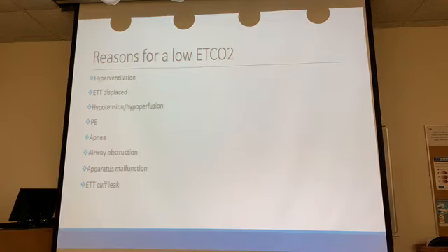Apnea, patient's not breathing, you're not gonna have carbon dioxide coming out. If there's a total airway obstruction, you got a big mucus plug stuck in that endotracheal tube or even in their trachea, they're not gonna be able to exhale CO2. They may not have a CO2 reading. Obviously, if your apparatus is malfunctioning, that's another reason. Or if you have an endotracheal tube cuff leak, your cuff is popped or there's leaking, a lot of that exhalation is going to go around the tube and the CO2 detector is not going to pick it up. It might give you a low reading, and you'll get an abnormal waveform. So keep that in mind, waveform and the number.